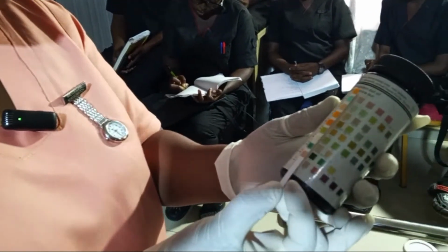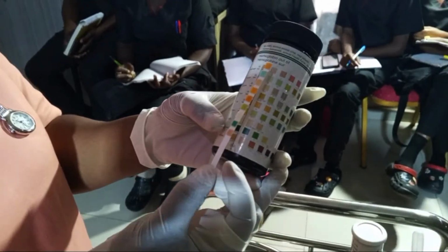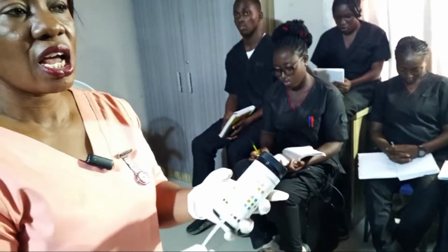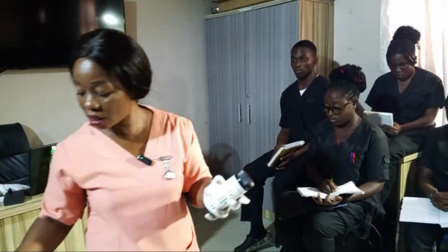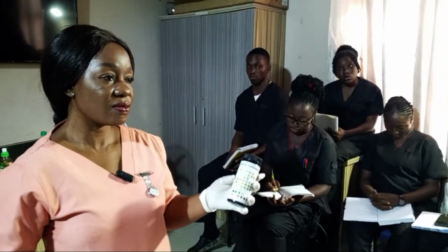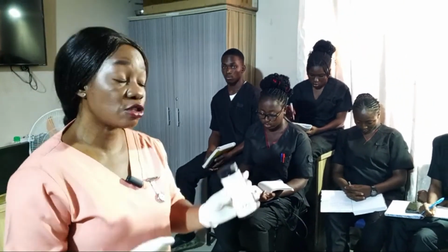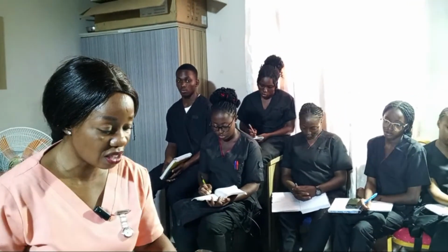So as we go on and on, depending on the question, then we note the result, isn't it? Then we discard it inside used instruments, right? So for now, the question says that we should just check for glucose, and there is no glucose in this urine. This patient is not diabetic, right? So we discard and we are done with this.